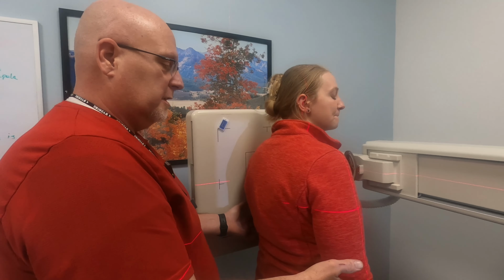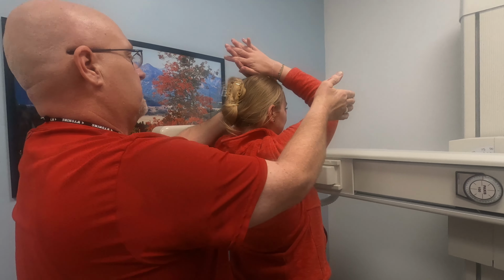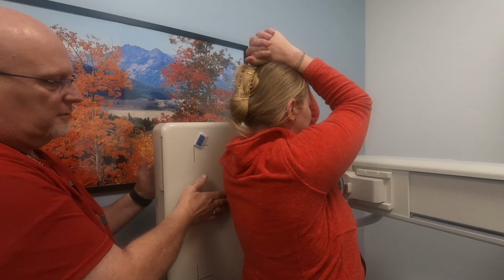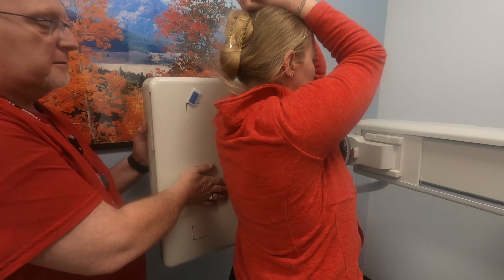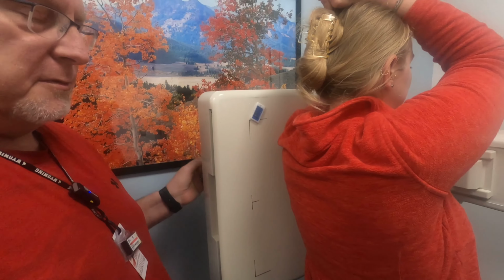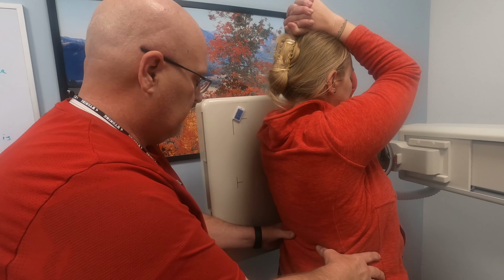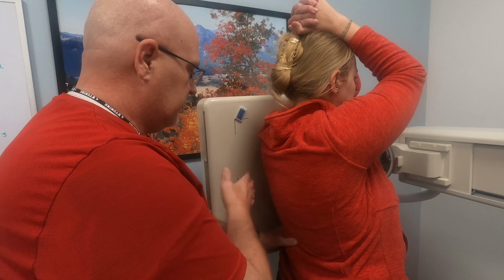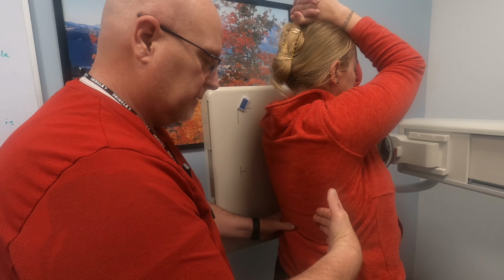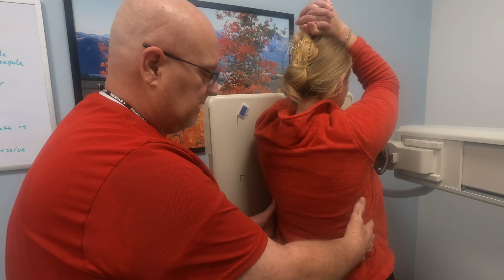So we're gonna have Kate bring her arms up in the air. I will usually have them rested on their head, but make sure they roll their elbows in anterior, okay? We want the side right up against the image receptor right here, okay? We don't want a bunch of space right there. So we'll have Kate as close to that image receptor as we can. Now, I will usually take the patient at the waist, and we want them to be perpendicular to the image receptor. Okay, so we want a 90-degree right angle right here. We don't want them out here like this or inside like that.